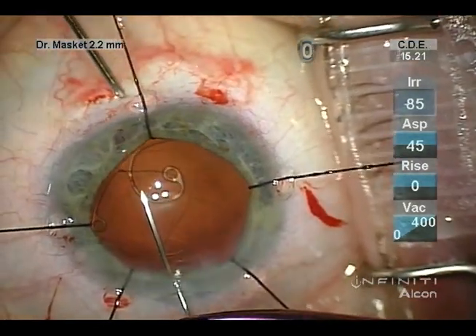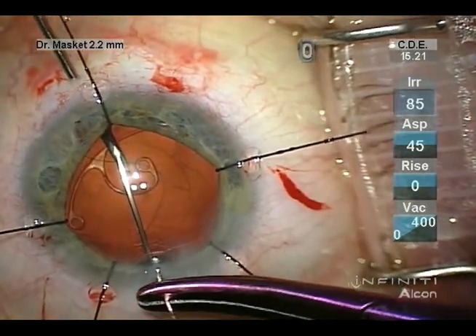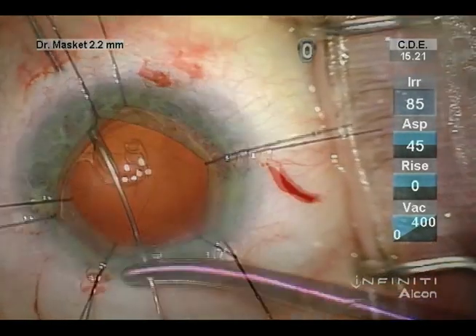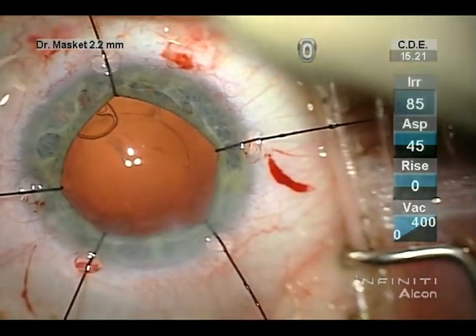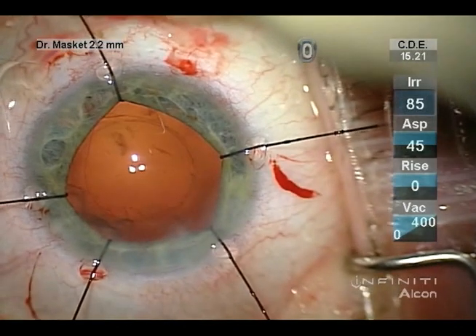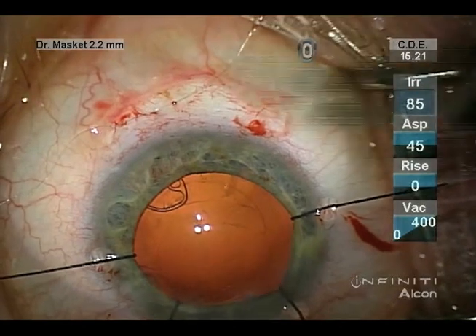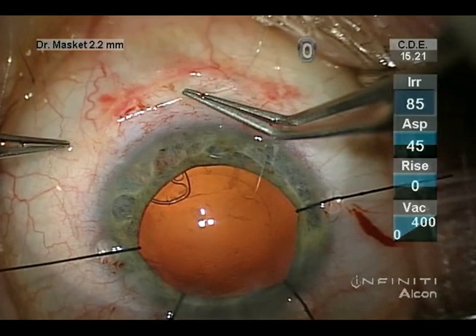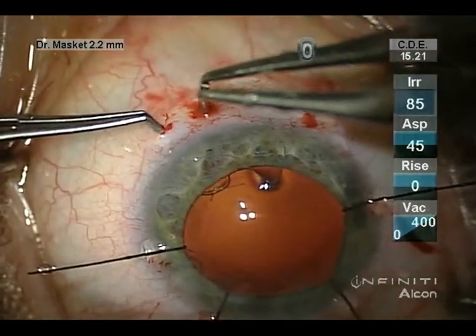Once both have been placed, and with great care not to snag the capsule bag with the sharp needles, they can be tensioned gradually. One wants to avoid over-tightening the suture so as to stress the opposing zonular fibers. A slip knot is used initially to allow adjustment of the tension, and then the knot is completed over the sclera and buried into the scleral tissue.